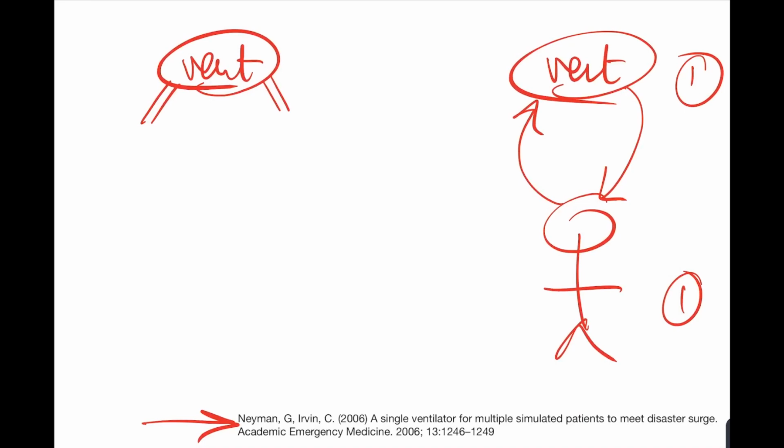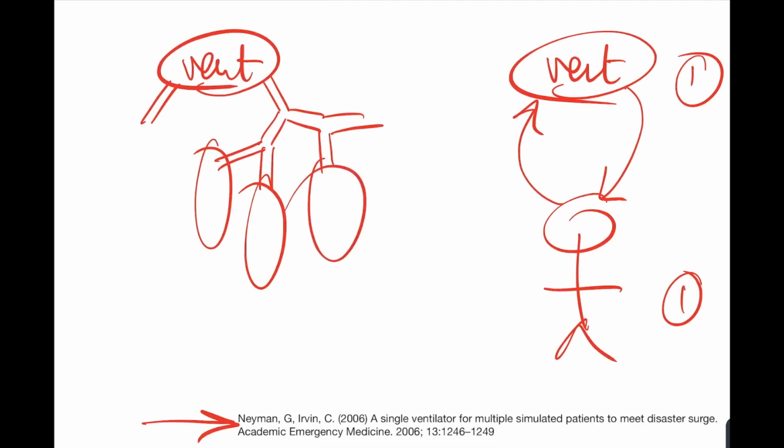So the port that is coming out of the ventilator, you either use a T tube or a Y tube, both will work, and you make that one port into 2 ports. And then once you have that, you attach 2 more Y tubes or T tubes, whichever one your hospital seems to carry, and you create that into 4 ports. This way you can have one patient over here, one patient over here, one over here, and then one over here. You see that you can intubate 4 patients with 1 ventilator. All you need are these T tubes or Y tubes that exist here.